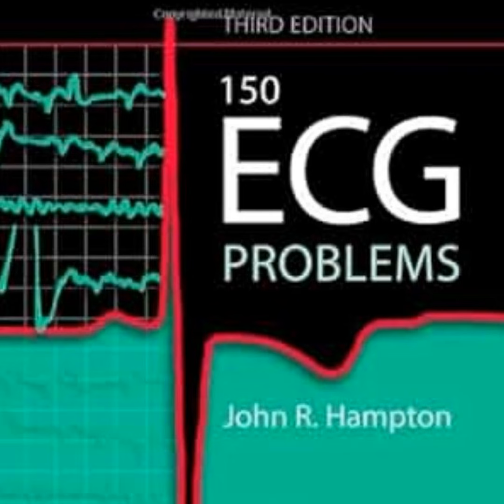This features a patient with a normal chest x-ray and an ECG showing normal sinus rhythm, but it's punctuated by frequent ventricular extrasystoles, or PVCs. Right. And seeing premature ventricular contractions on a rhythm strip is incredibly common. Yeah, happens all the time. It does. And for a lot of learners, their immediate instinct is to look at those ectopic beats and consider antiarrhythmic suppression. Like, we need to fix this rhythm. But the golden rule says.